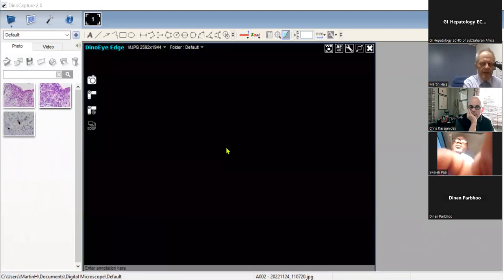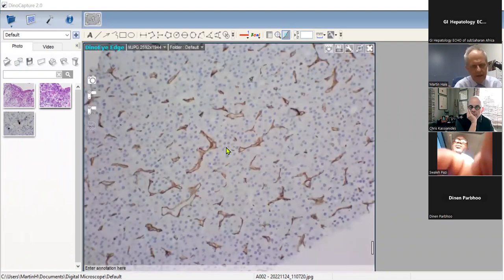So in summary then, this is an example of a trabecular hepatocellular carcinoma, and potentially it's a relatively well-differentiated tumor. Doesn't really change the prognosis much. As you've heard Dr. Barbara say, there was venous invasion, so the prognosis would be guarded in this particular patient. But I think it's a pretty good example then of a typical hepatocellular carcinoma. Dunan, over to you.